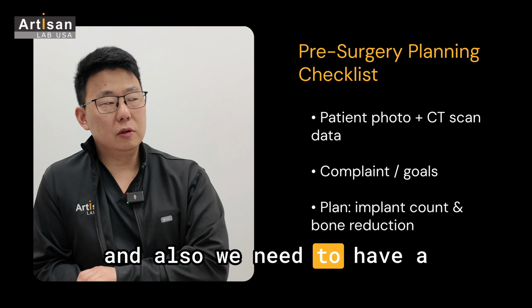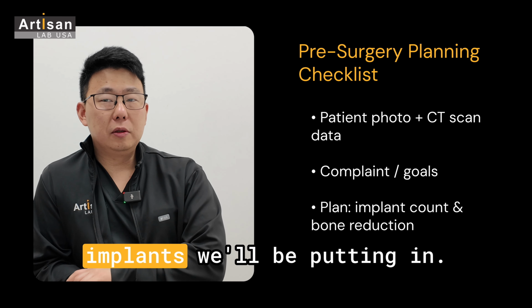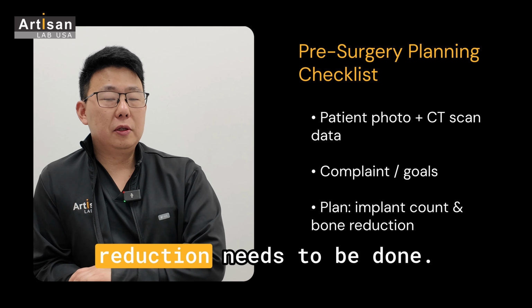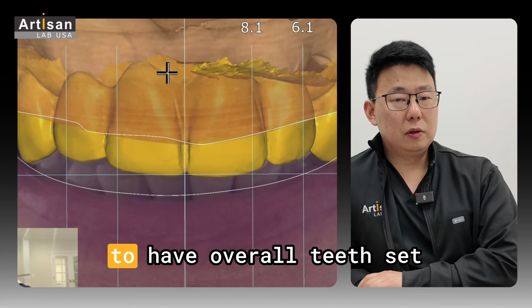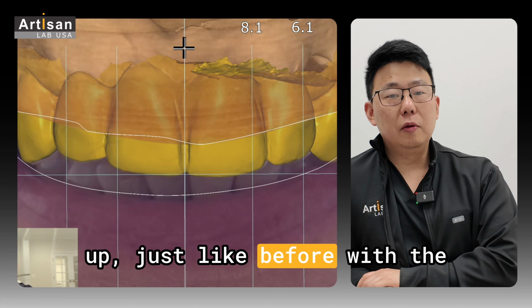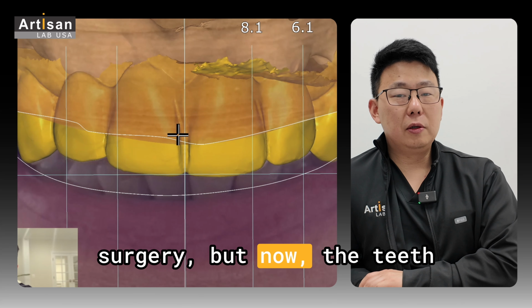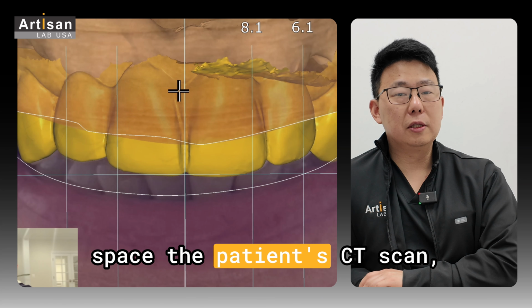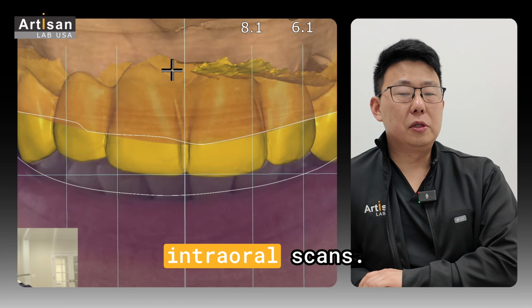And also, we need to have a plan before the surgery day. We need to know how many implants we'll be putting in, and also how much bone reduction needs to be done. We need to check the transition line, and we need to have an overall teeth setup. Just like before with the analog workflow, we used to do teeth setup before the surgery, but now the teeth setup is done in the digital space. The patient's CT scan, face photo, and the intraoral scans.